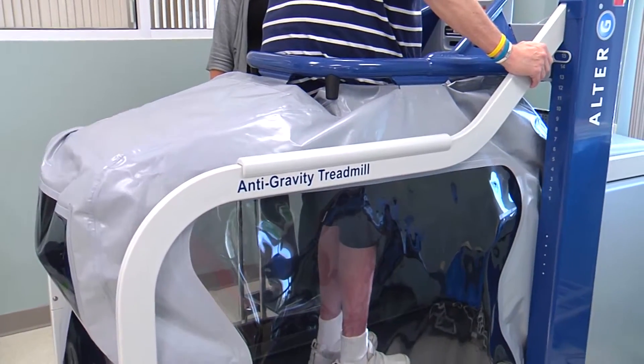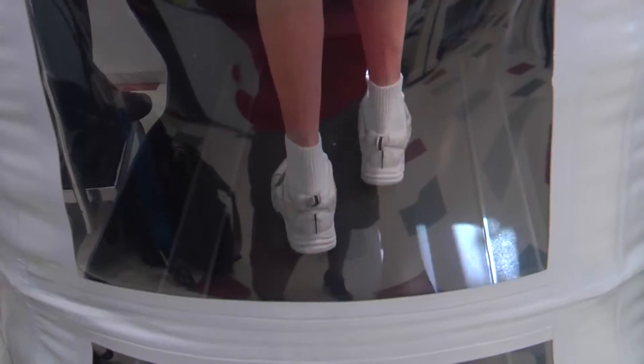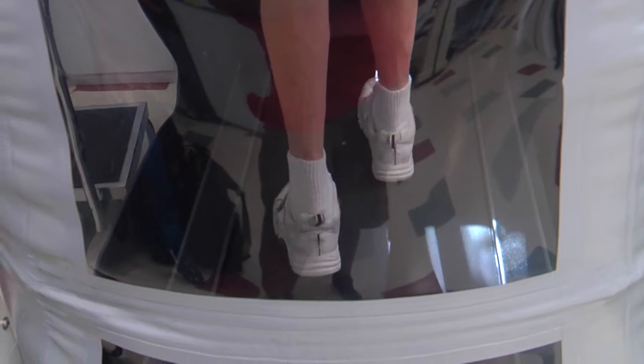Giant step or small leap? This anti-gravity treadmill is helping rehab patients make great strides in their recovery.